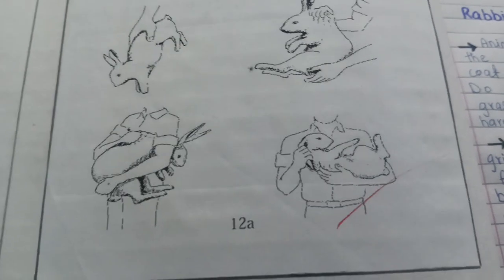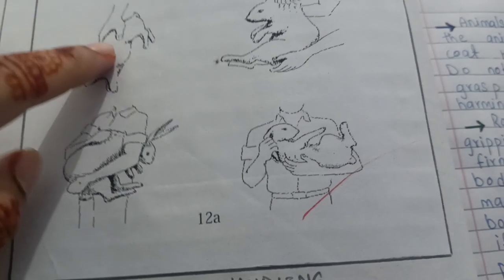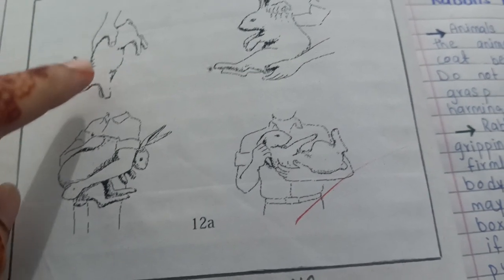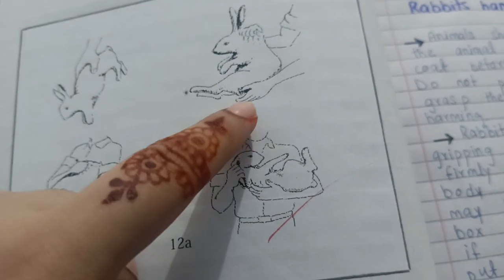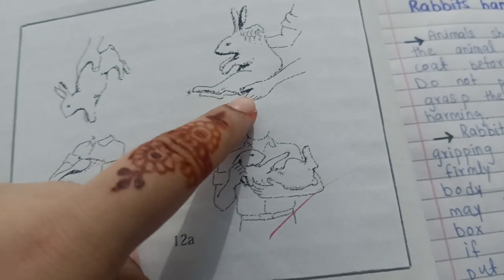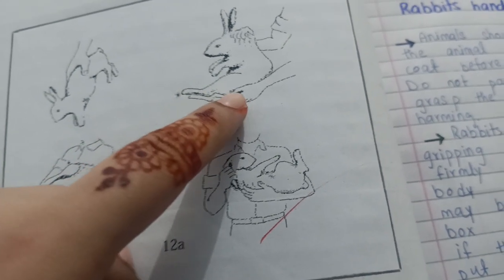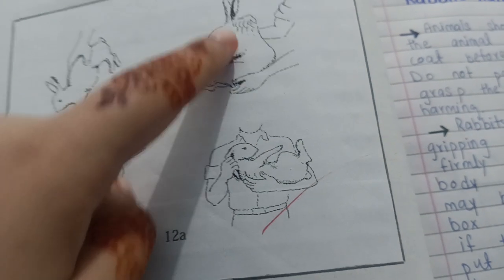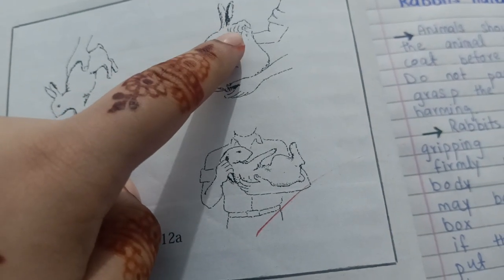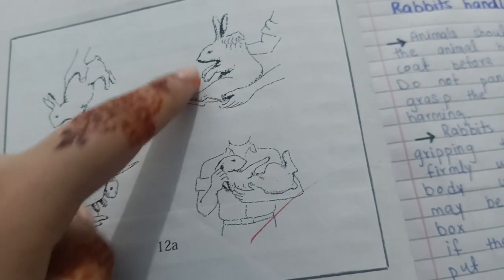So here the picture shows how to handle it. Okay, you can handle it in these ways. You can handle it from here, but this way is not so correct. This way is very good because you are supporting the hind quarter, meaning the hips, thighs and legs of the rabbit, with your hand, and you have grabbed or lifted the rabbit by the back of her neck.